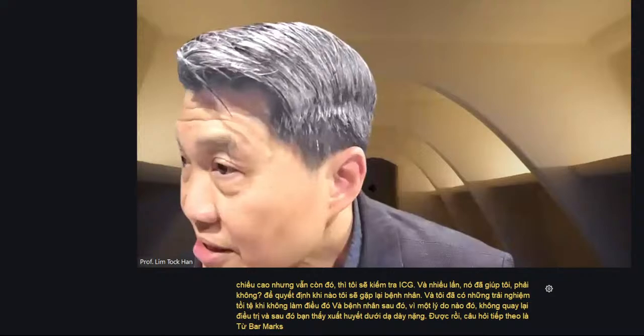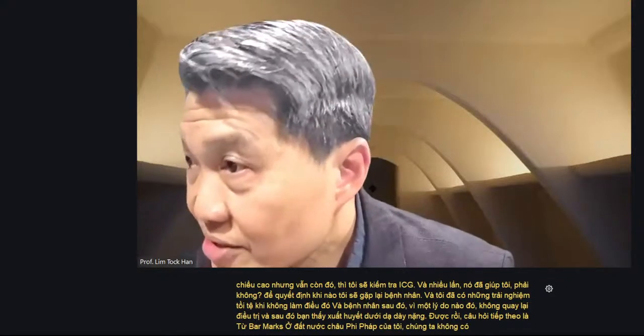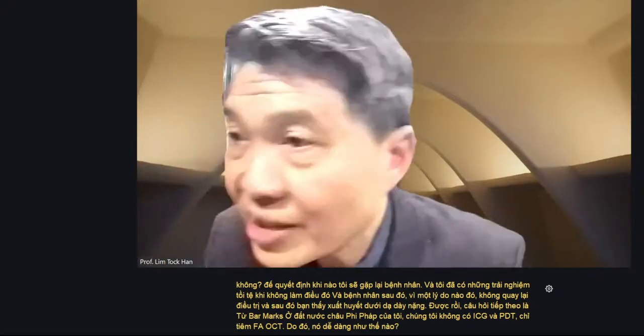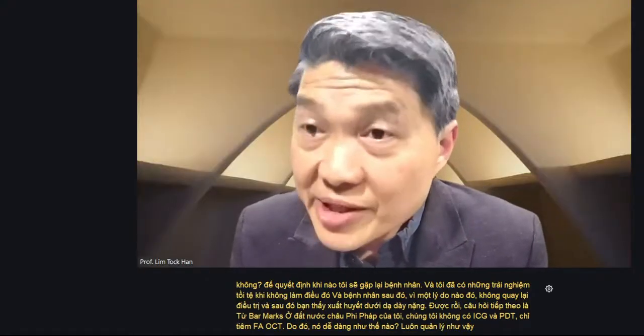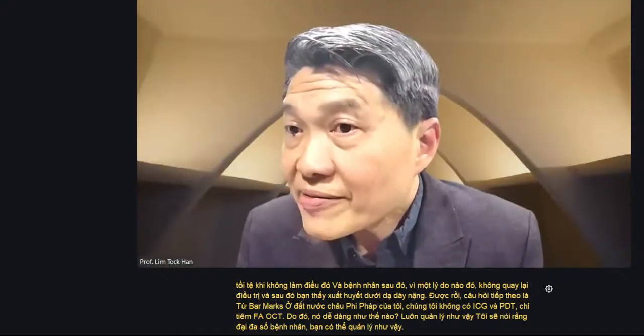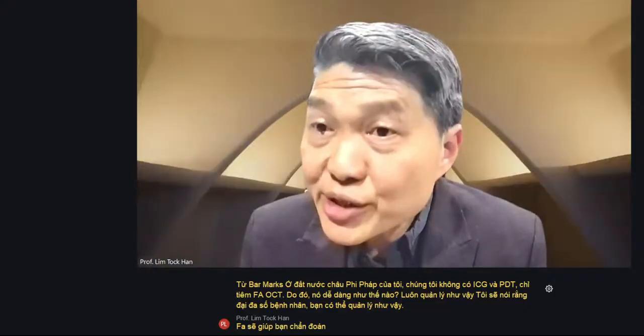In my French African country, we don't have ICG and PDT, just FA, OCT, injection. Therefore, is it easy to always manage like that? I would say the large majority of patients you can just manage like that. FA would help you diagnose quite a number of CSCR patients as well.